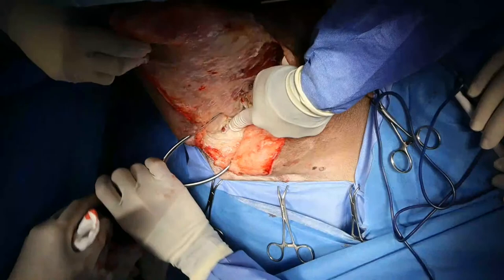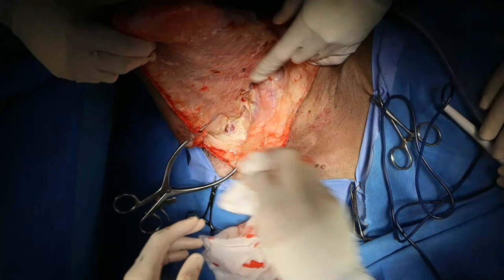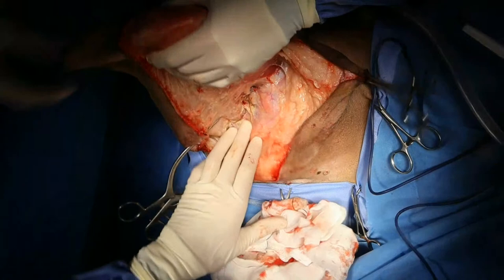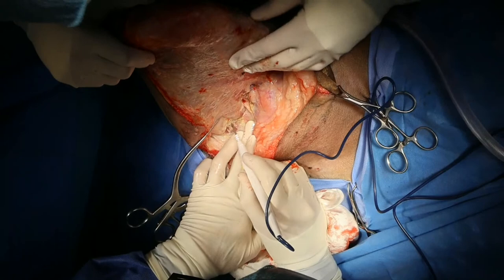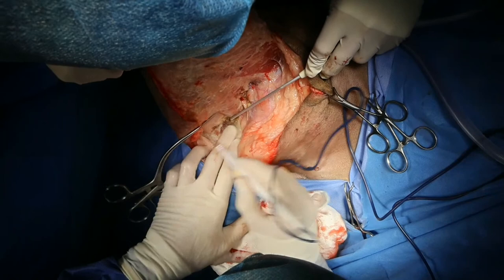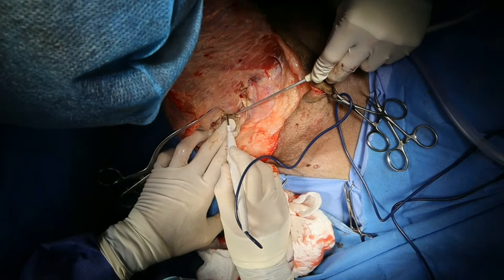So that's the junction between the two adductor muscles there, and that's the pubic symphysis right there. All right, and Ben, what I've done first is I've harvested a big flank fold flap, so that we'll use that to cover a defect. So now I'm just going through the junction between the two sides of the adductor muscle, right down to the pubis here. And staying on that junction between the two sides, we're trying to avoid getting a lot of blood vessels. So that's a fairly avascular region of those two muscles.